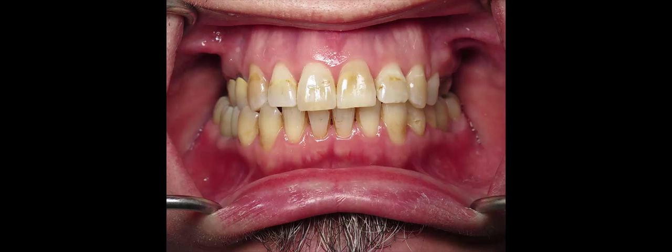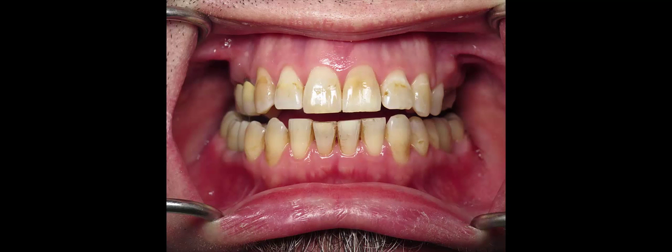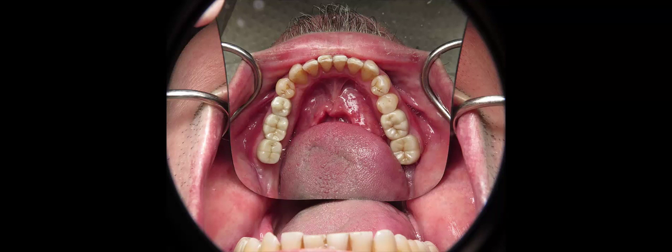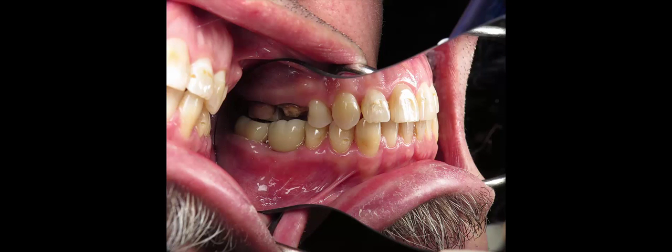Those are the abutments that will be sandblasted. They're prefabricated, not customized because the implants are placed very straight. The final photos show the monolithic zirconia crowns placed on the lower molar teeth. You can actually get an idea of where they are back over here and back in this area. Here's the implant crowns in this area right over here.